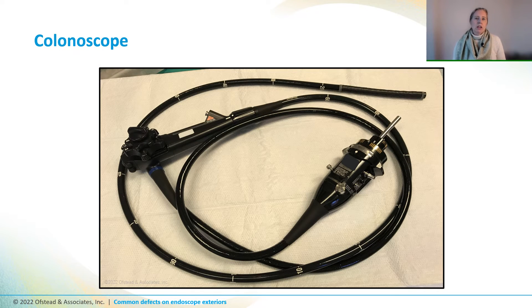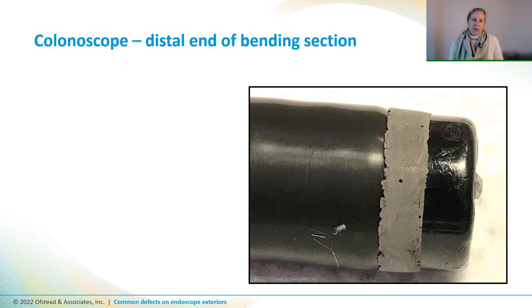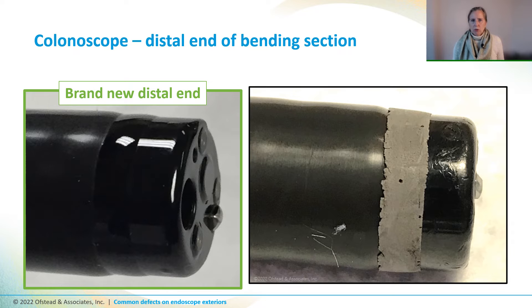Now we're going to look at a colonoscope. The adhesive band near the distal end has disintegrated and it has pitting and jagged edges that make it impossible to clean and could injure the patient. Just as a touch point, here's the distal end of a brand new GI scope — and this is how the glue band should look.